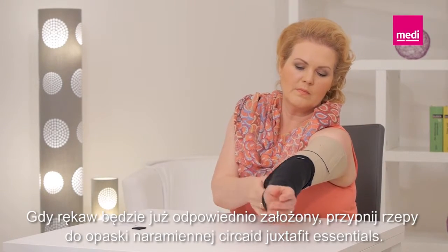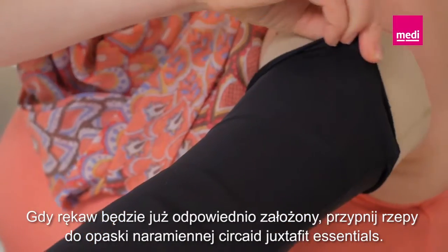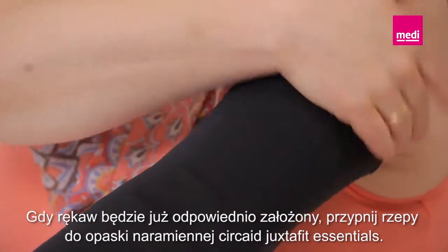Finally, attach the Velcro tabs of the cover-up to the Circade Juxtafit Essentials arm once it is in the desired position.